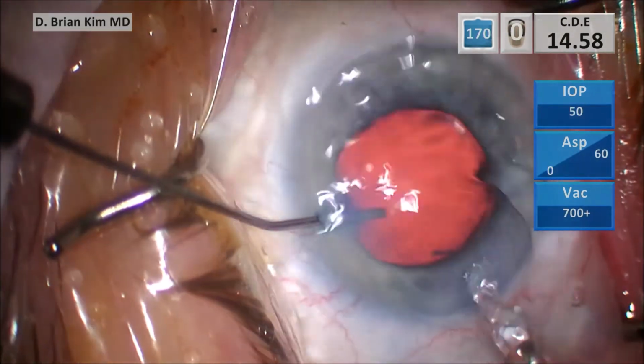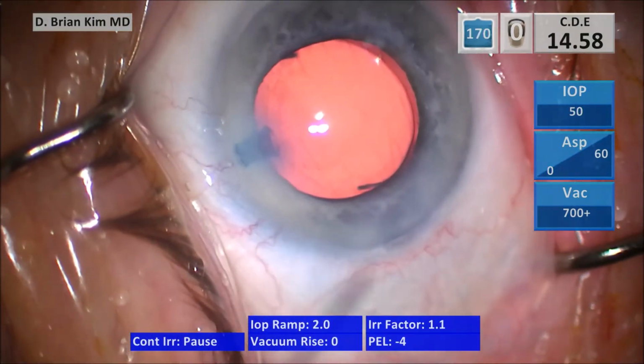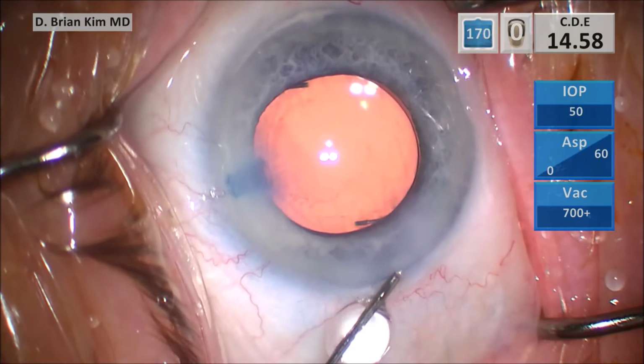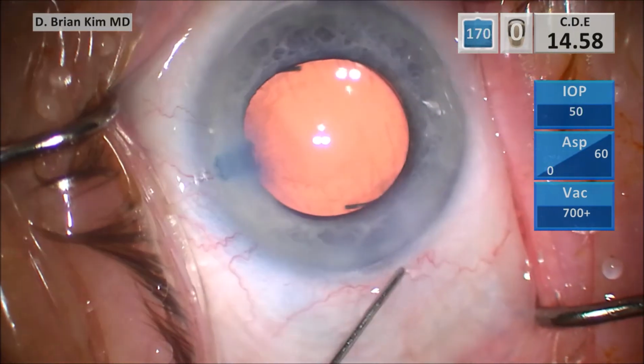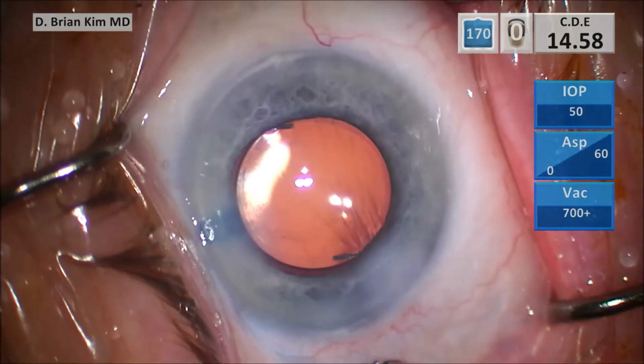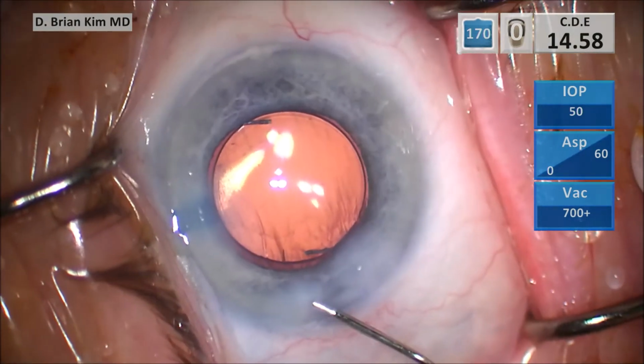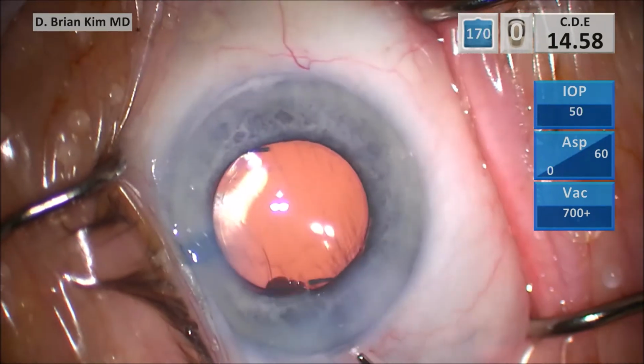And so the way you do that is you get out to the periphery and you fracture from the terminal side. And by fracturing from the periphery, you're able to get a fracture point that involves the posterior aspect of the lens. And because there are lamellar fibers, that fracture propagates through and through, and you get a complete chop every time when you perform this technique.